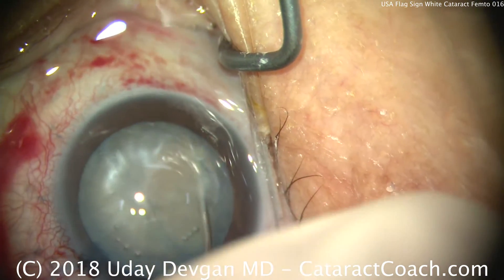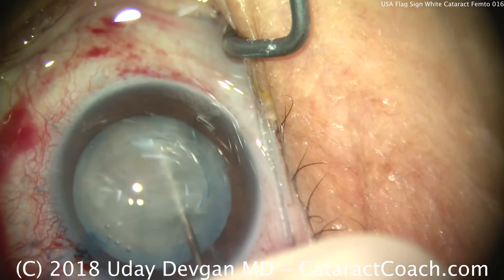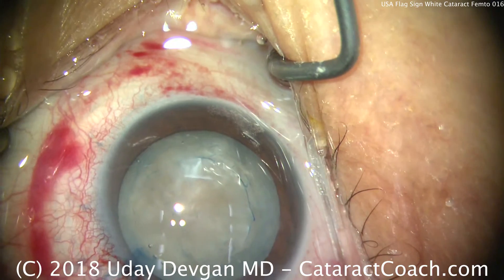Now the nucleus — we're just going to rotate. You actually don't need much hydrodissection, if at all, because this white cataract has liquefied cortex.